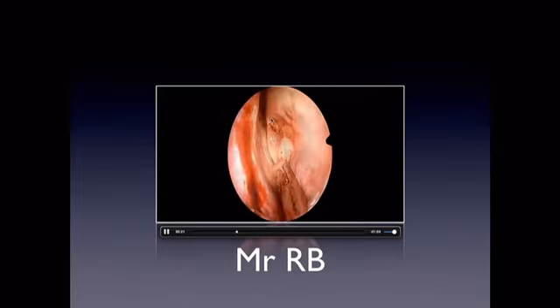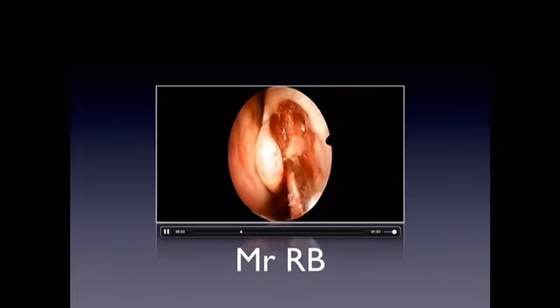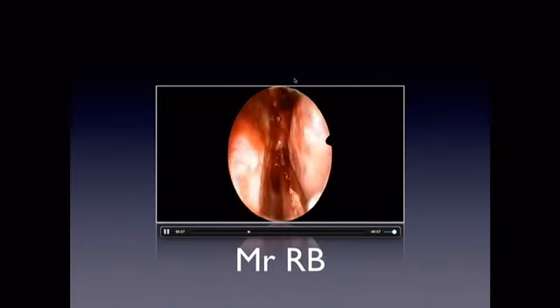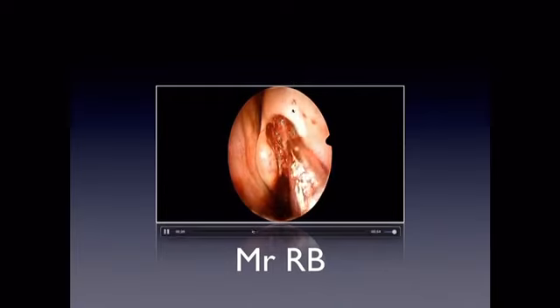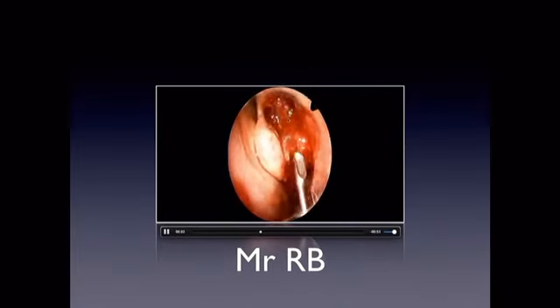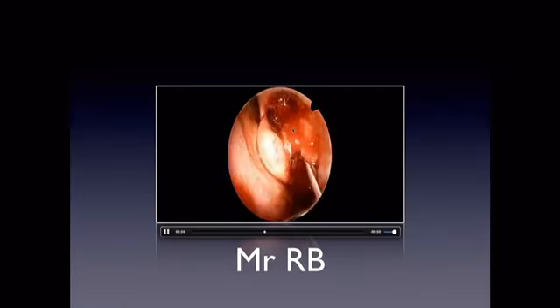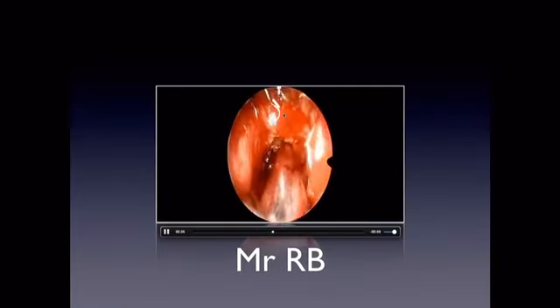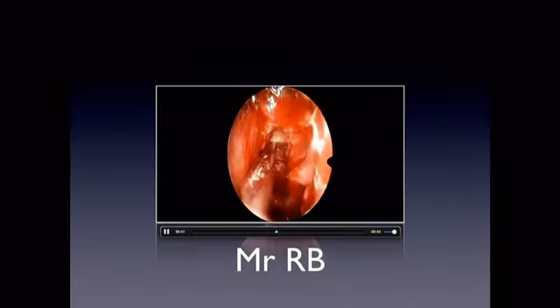They're white, they're sort of pale looking, but then we get here and this is when it started to look a bit funny. So you can see those polyps look different. I knew that straight away, but I looked back at the scans, didn't quite appreciate at that point in there, but it's starting to look what we call beefy. It's very granular looking. So taking down the agger nasi cell and then trying to find the base of this disease.